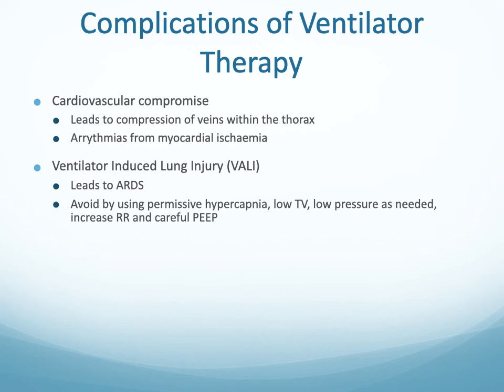We avoid ventilator-induced lung injuries by using permissive hypercapnia and using your lower tidal volumes and the lowest pressure that you can, and increasing your respiratory rate, and just be really careful with your PEEP to prevent atelectasis, but also not to keep those lungs so expanded that they're going to get damaged.